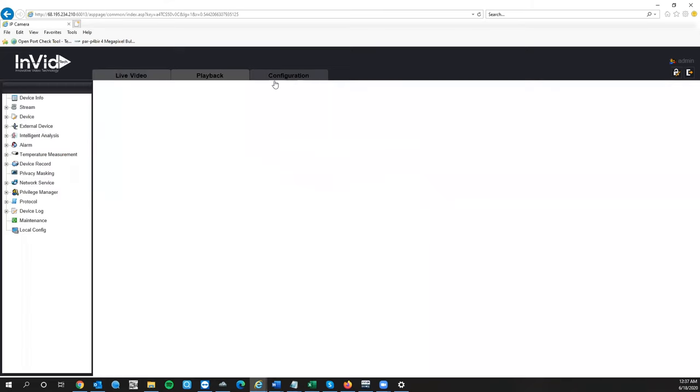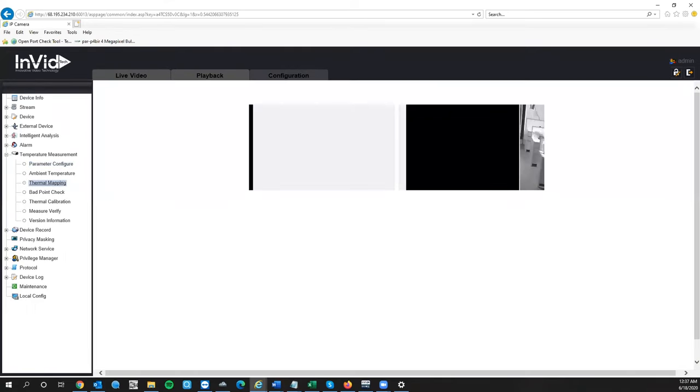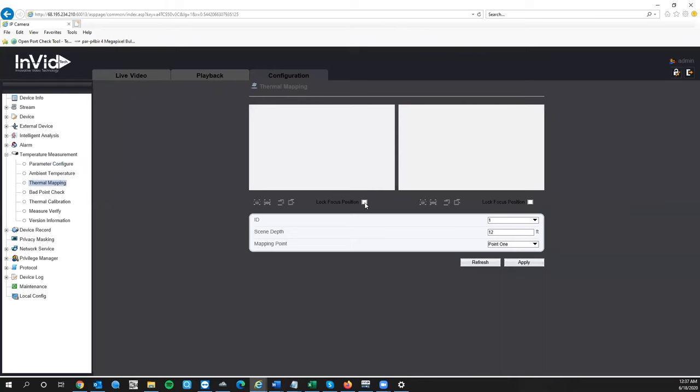One last thing: go to Configuration, Temperature Measurement, Thermal Mapping, and make sure you lock your focus points. That way nobody can zoom in or out accidentally. If you zoom or unfocus the lens, it changes everything and you'll essentially have to go through the setup process again to make sure everything is properly calibrated.